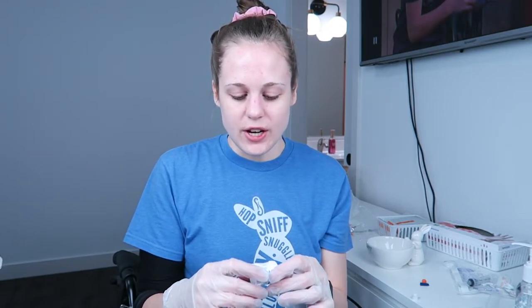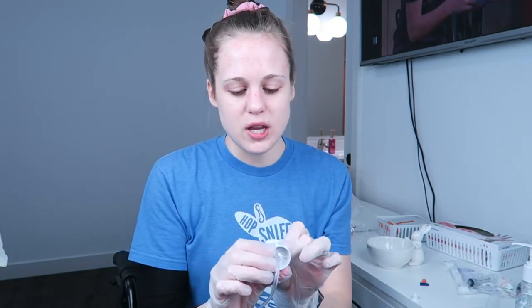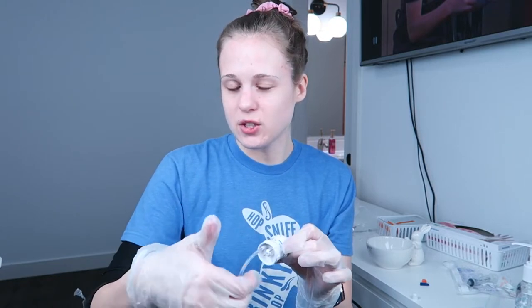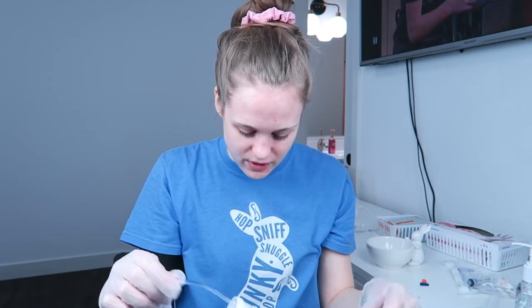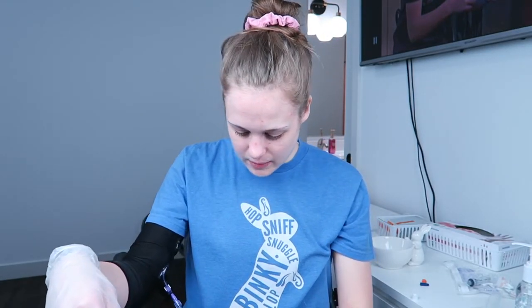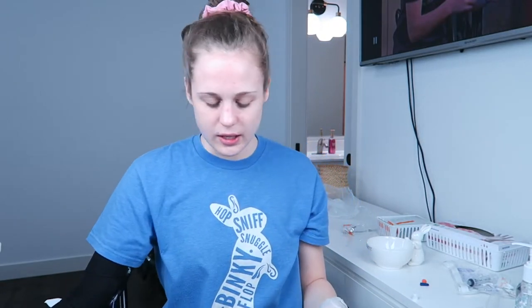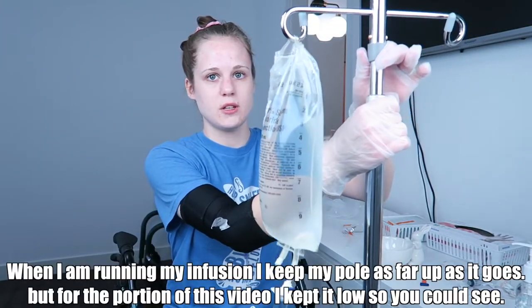So I started out at 250. Sometimes I leave it at 250 the whole time and just run it over 4 hours. Otherwise, you can actually go past the 250, and even though it doesn't have numbers there, sometimes you can put it between 250 and wide open. Anyways, I'm going to leave mine at 250 for now. Now I'm going to make sure all my clamps are unclamped. This is unclamped, and this one is clamped, but I'm going to unclamp it once I raise the IV pole. I'll raise it a little bit so you guys can see.